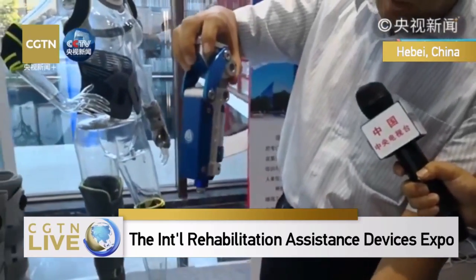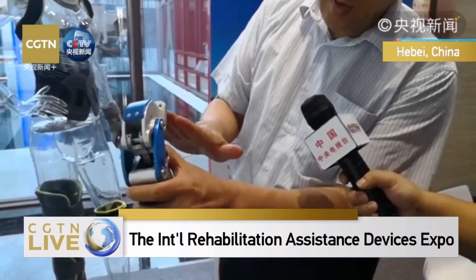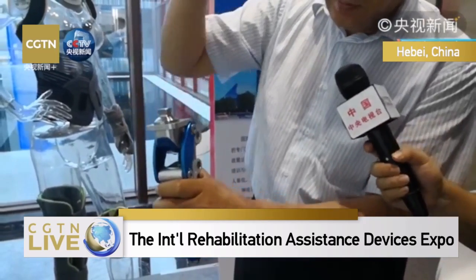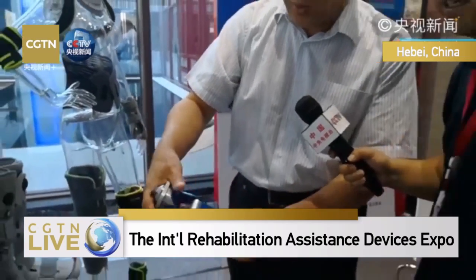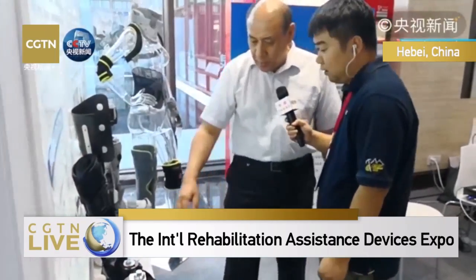It can be connected to your thigh and your calf. And if you sit down, it can bend like this. And if the patient is walking, it can help you to complete your motions. And when you're sitting down, it can serve as a function of a knee.